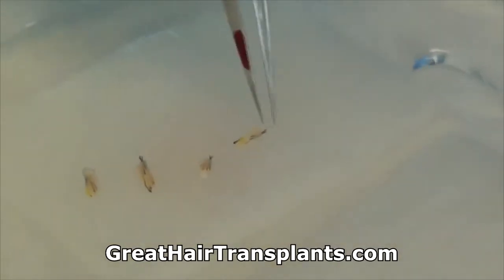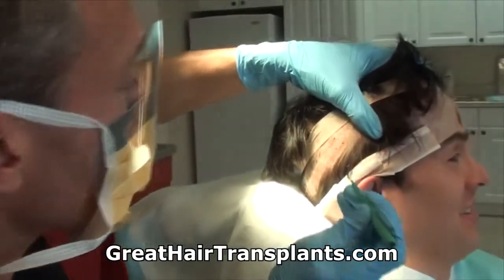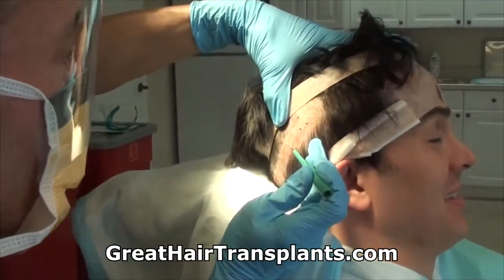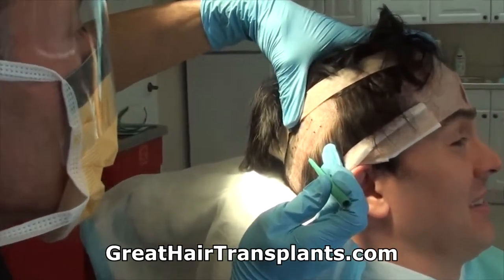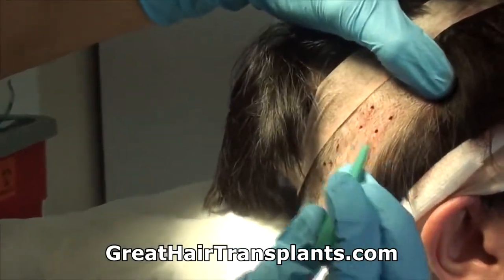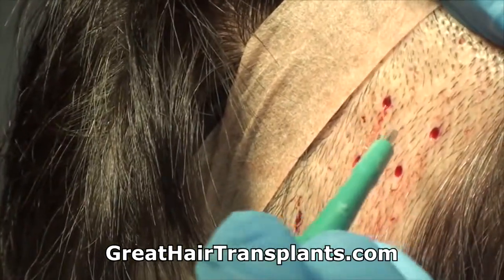3. 4. Want to do a 5th one for the camera? So let's try one more, and let's go right by. Let's get in. Try to find a good one so we can get some hair. And this is what they're going to do for you. They're going to try to pull these out one by one, just like this.